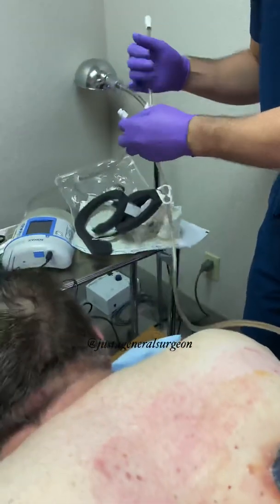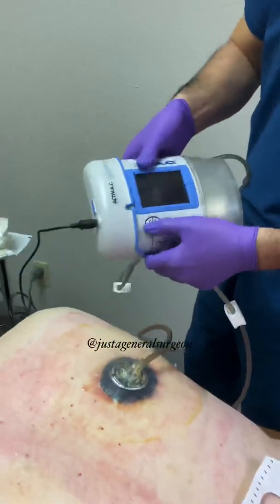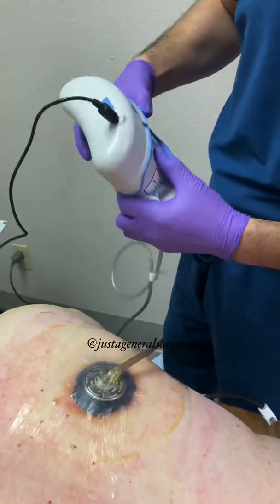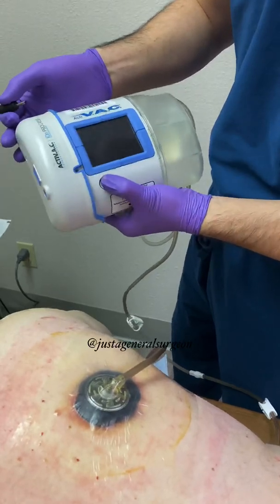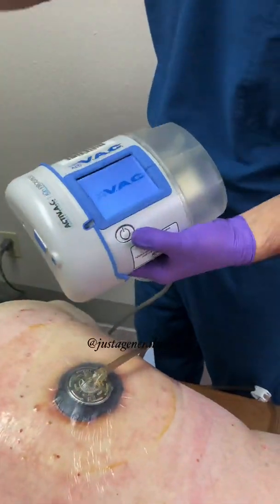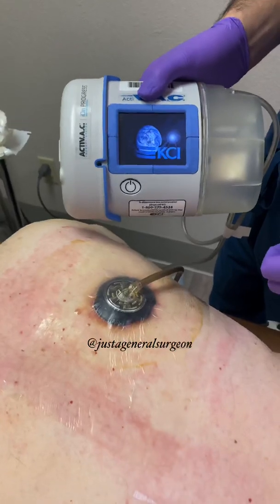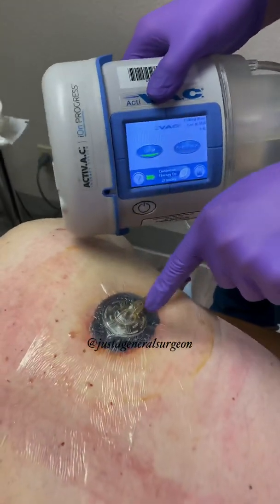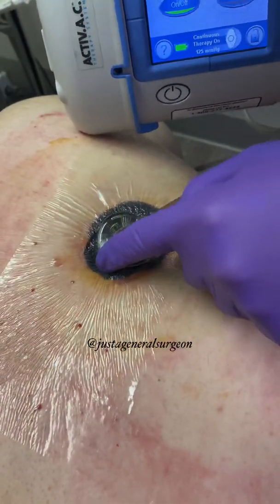Then we hook it up to the wound VAC system here and turn it on. When you turn it on, it should create a suction, and now you can see that the sponge is now compressed because all the air has been suctioned out.